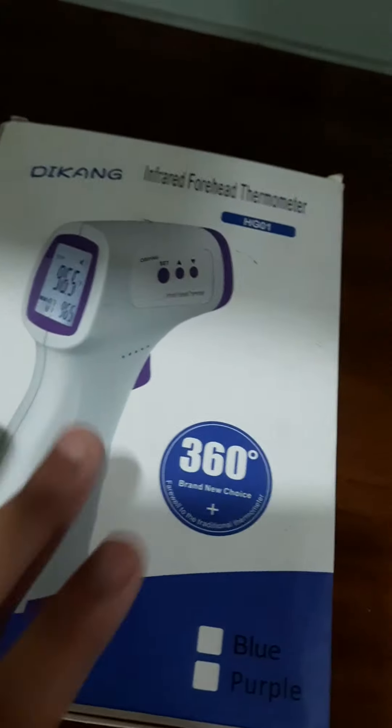Now let's look inside the box and show you the specifications and the opening size.